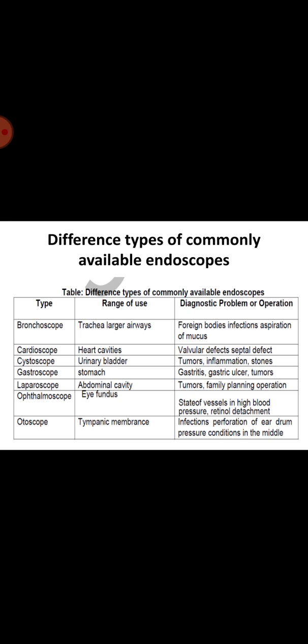It is also very useful for examining the small intestinal mucosa or diagnosing Crohn's disease. The capsule usually passes through the digestive system within 24 to 48 hours. This is a relatively new technique and was given FDA approval for use in the United States in 2001.